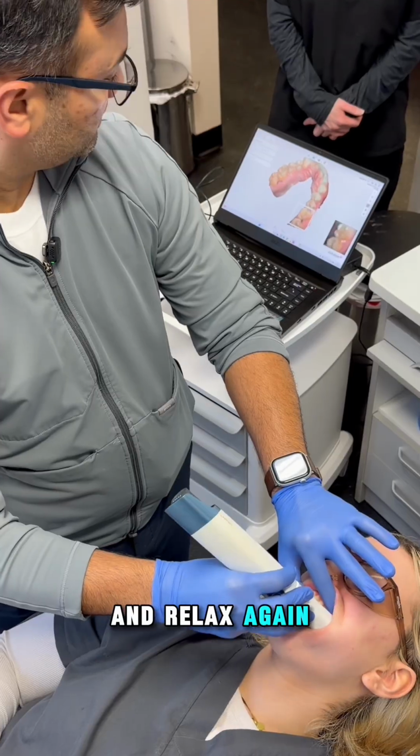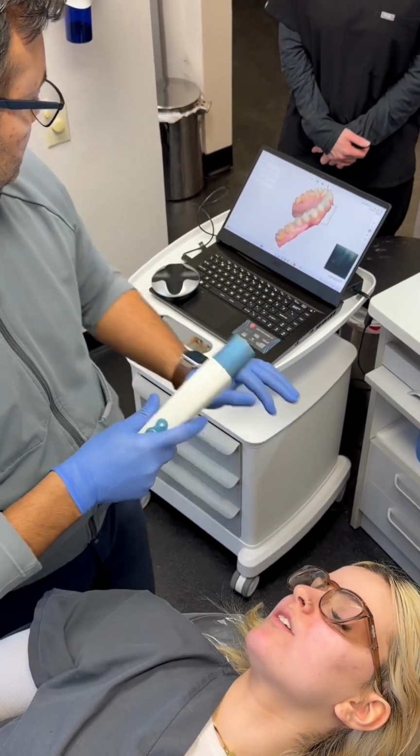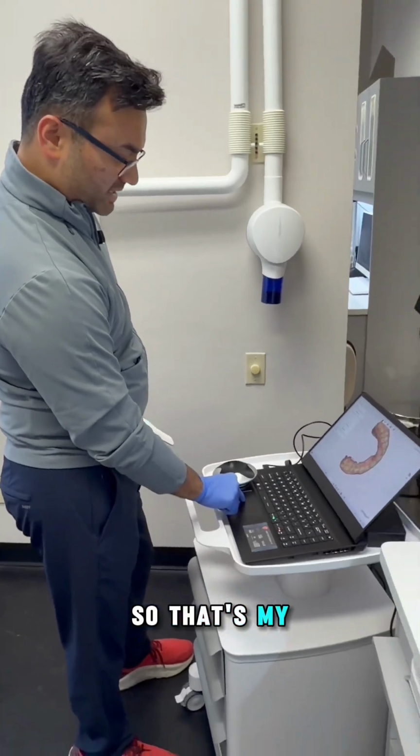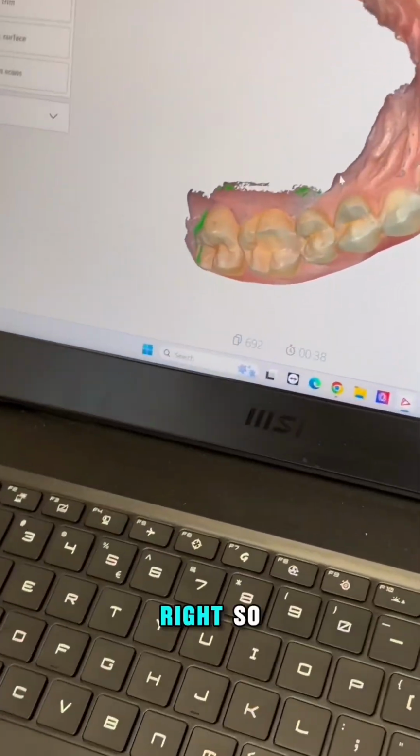And relax again. So that's my scan, and look at the time here, 38 seconds, right?